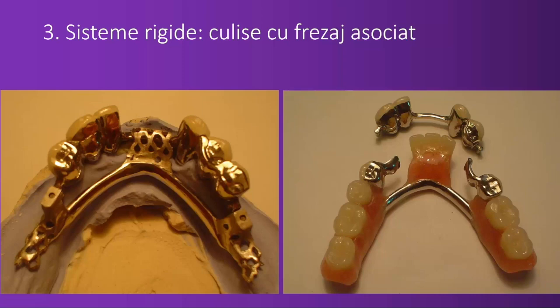and we couldn't use the elastic effect of the matrix, because I had those millings that were creating everything, all the system to be rigid, real rigid. You see how the arm was getting perfectly into the neighboring tooth, the fixed tooth.